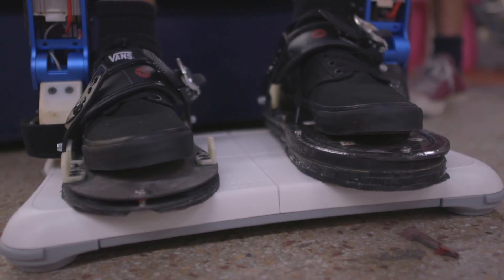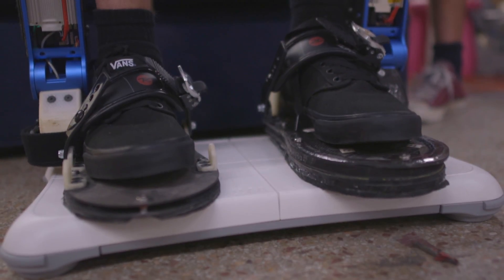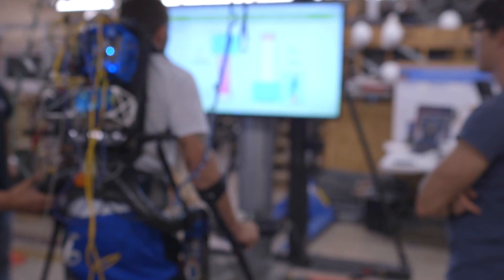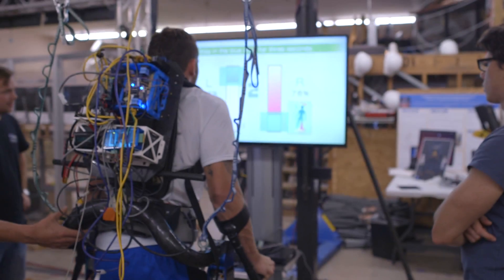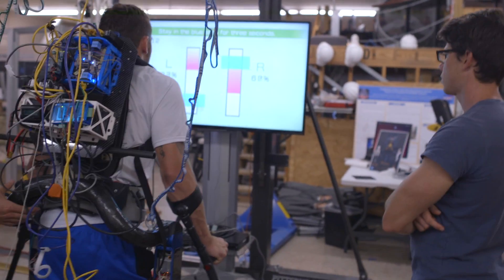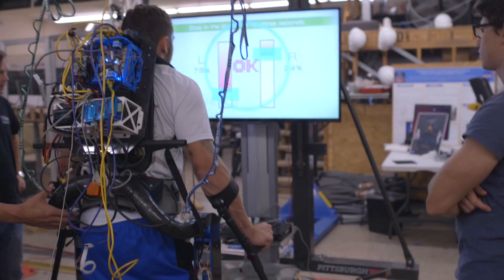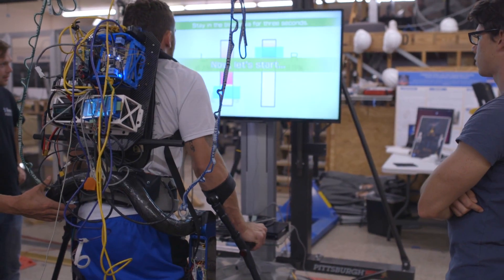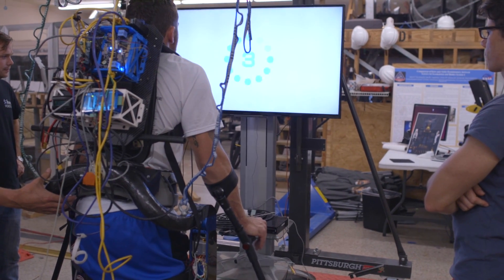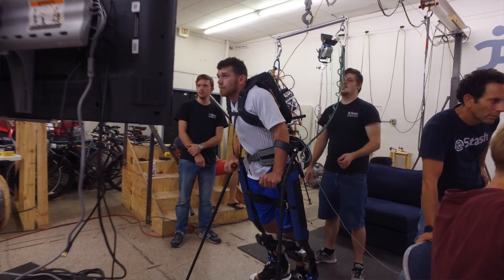So what are we doing, Peter? Testing balance control with the Wii balance board. So it tells you how your mass is positioned. We get feedback through our feet through proprioception, able-bodied people, but Mark has no proprioception in his feet, so he doesn't know how his weight is distributed. This board measures how his weight is distributed, so it gives him control of it. Lets him close that loop.